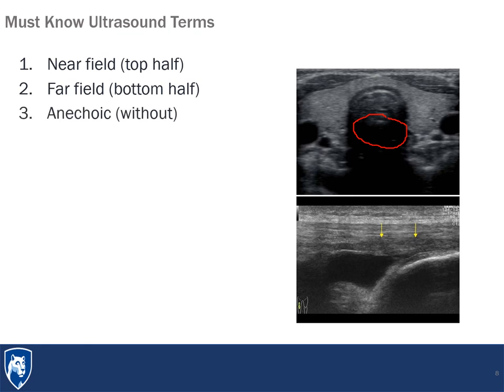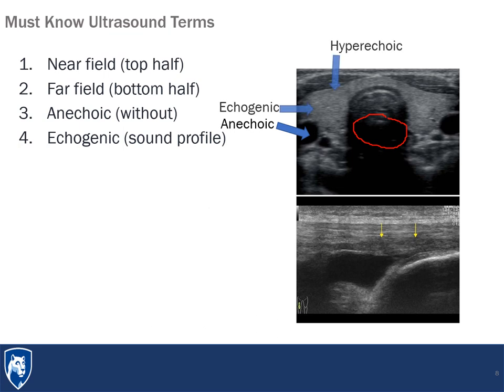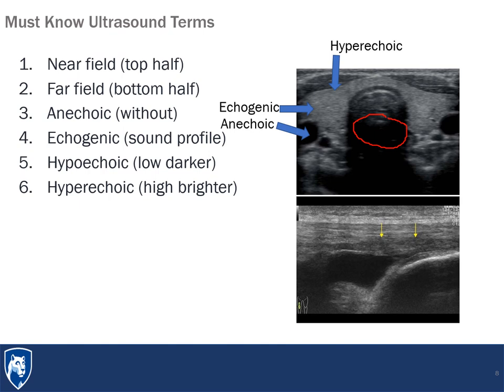When we discuss each tissue inside the image, something without echogenicity is known as anechoic, like these blood vessels seen here. Everything else has sound bouncing back from it, so it has an echogenic profile or a sound profile. Those could be hyperechoic if they're brighter intensities, or hypoechoic if they're a lower, dark intensity, and these tend to be comparative terms. So the muscles seen here in the neck are actually more hypoechoic than the thyroid seen here in the neck, which is more hyperechoic.